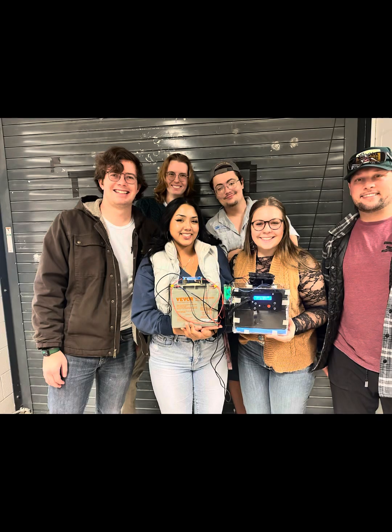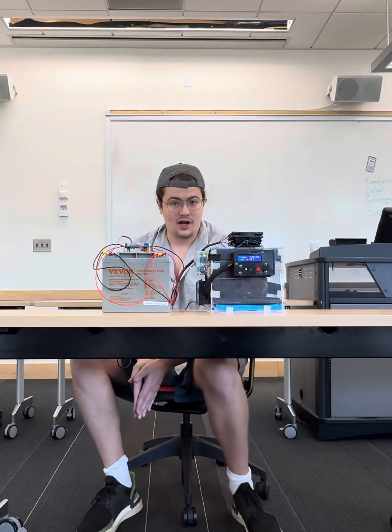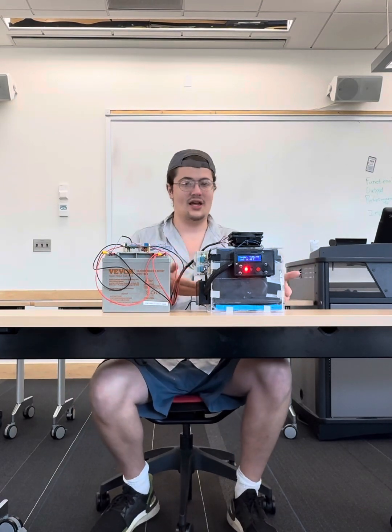We are Arctic Autonomy and we designed an off-grid vaccine cooler. Vaccines save lives, but sometimes those lives are way the heck out there in the middle of nowhere. In order to fix this problem, we created this prototype, a box that keeps the vaccines cold, a battery that powers all the functionality of the box.